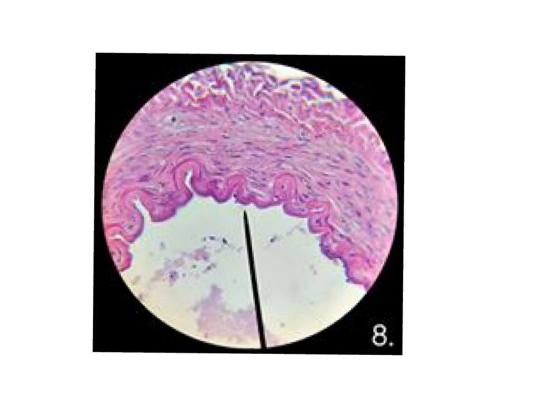Here we have the last structure in this group of hollow organs, which is the basilar artery. The basilar artery comes alone with no vein. The basilar artery is one of the fixed slides because it is small, and we want you to look at it very rapidly, so it is fixed with the cellotape.